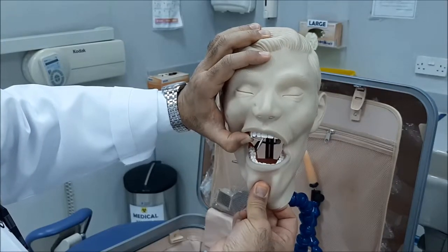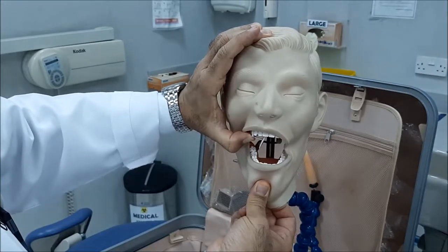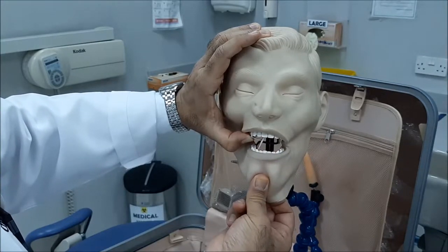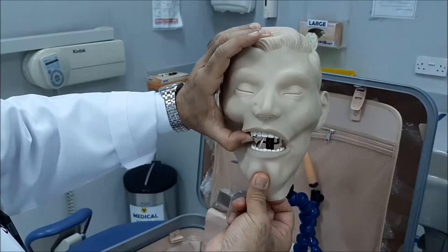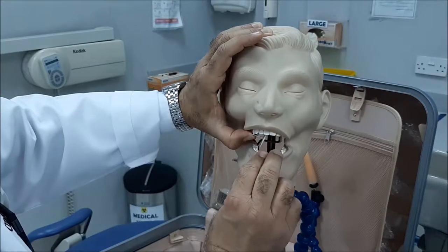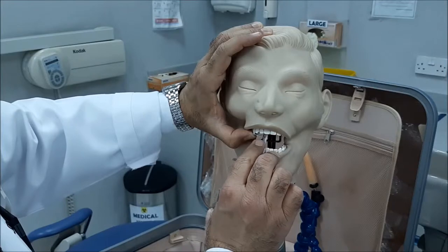Now, ask the patient — I'm supporting the film with my thumb on the teeth that I want to see — and then you ask the patient to close. When the patient starts to close, you watch this end of the film. If the patient starts to bite with your finger, take it away.